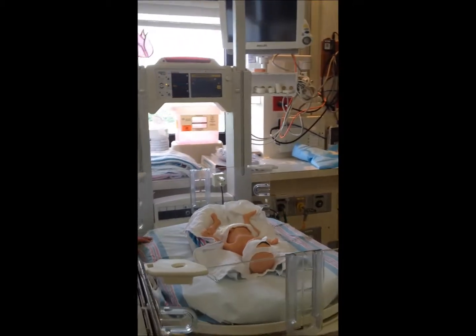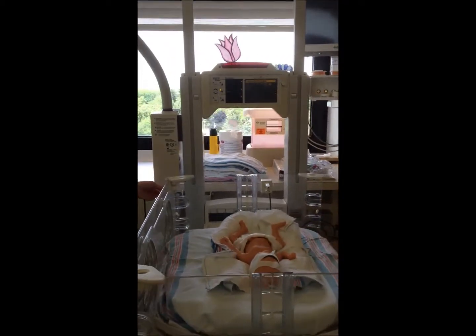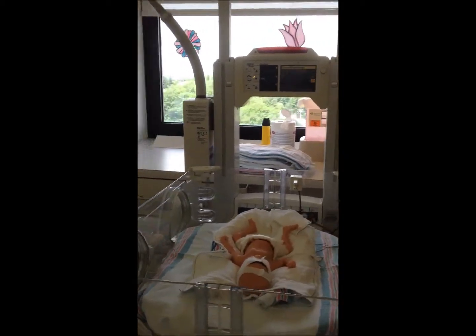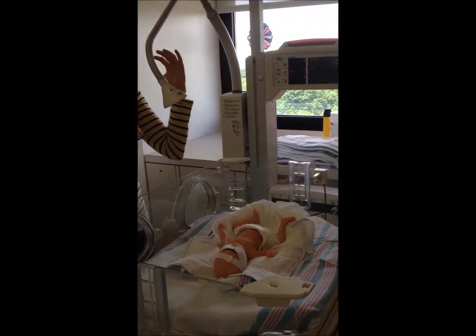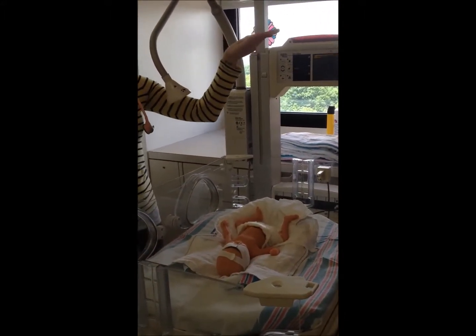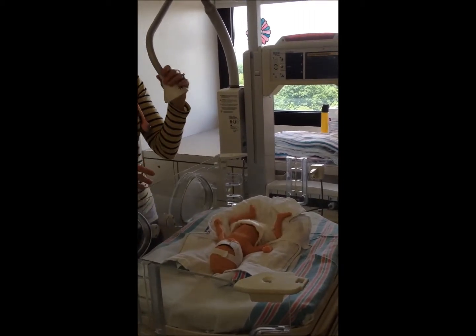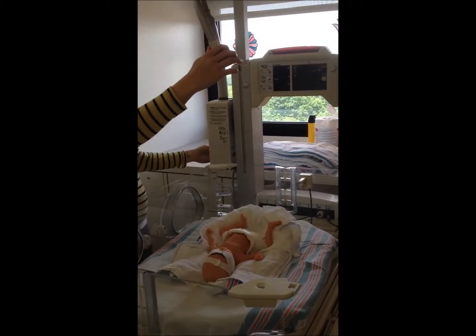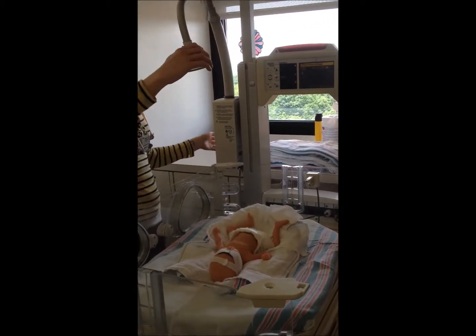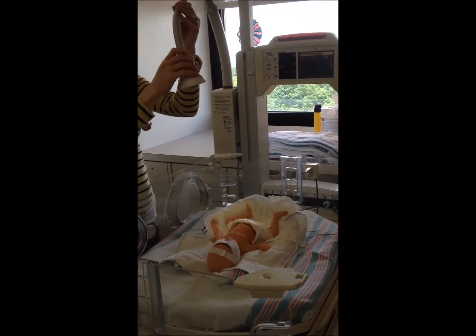That's great. And the bed does have a phototherapy light built into it also, correct? Yes, that's why oftentimes babies who are in a typical isolette, we would have to order a special bank of phototherapy lights that sits next to the isolette. It's kind of cumbersome, it gets in the way, and we don't have much space here. These beds come with their own phototherapy light that we can just turn on, and it will provide the right spectrum of light for these little guys, and it's right here on the bed.